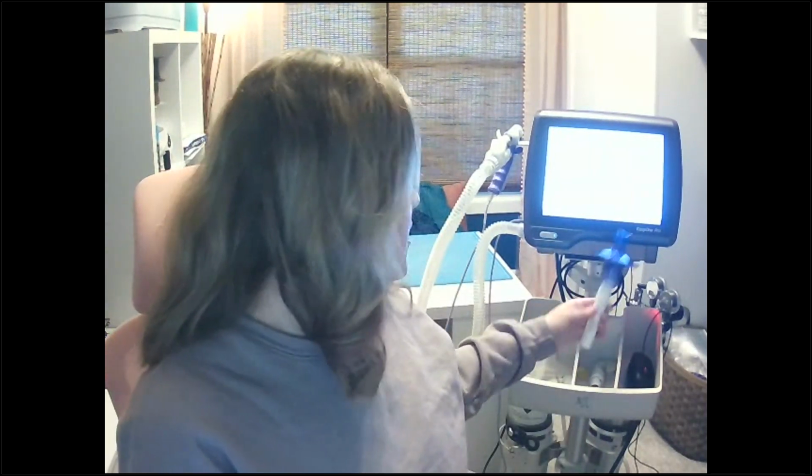And I'm also going to show you the example with both of our mouthpieces for the Pro. So on the Pro filter kit, I don't have this one colored in, but there is the arrow on the top of the mouthpiece. And then as you can see on this mouthpiece, I have colored in the arrow on the top of the spiret. So whichever option you're using, you would use this for your complete PFT, or you would use this. You would not need to switch back and forth between solutions.